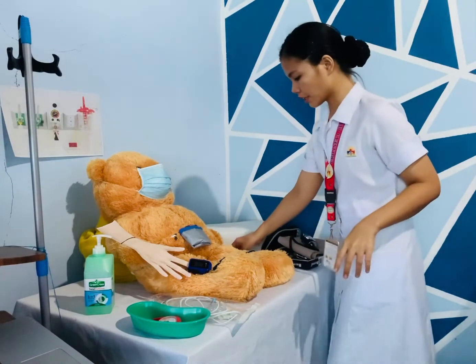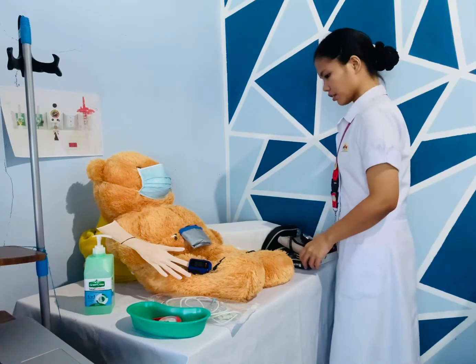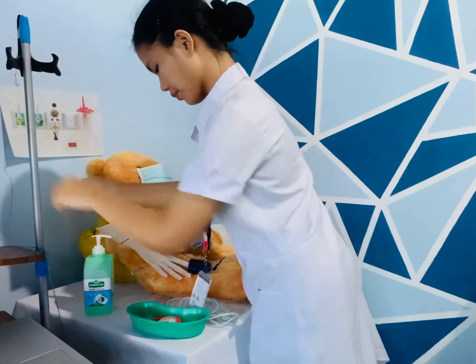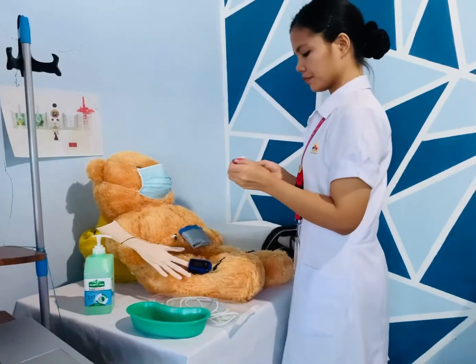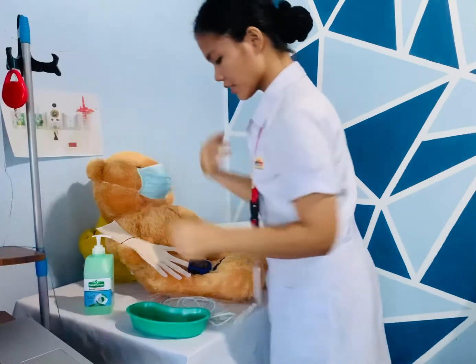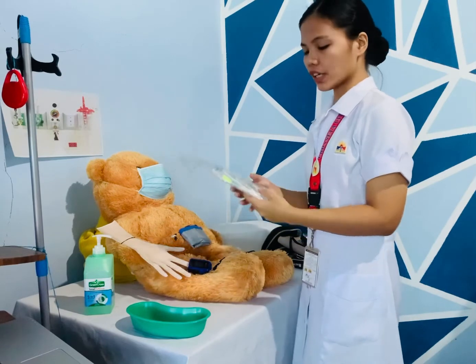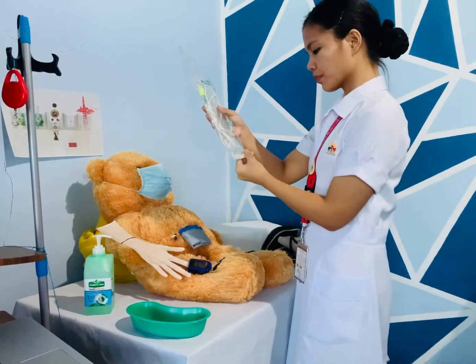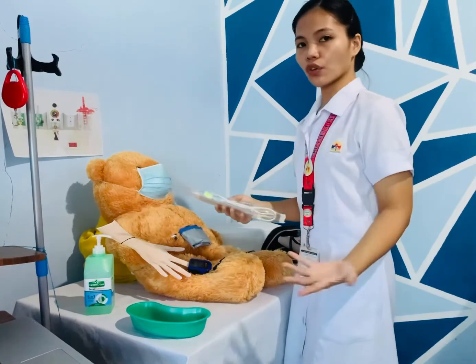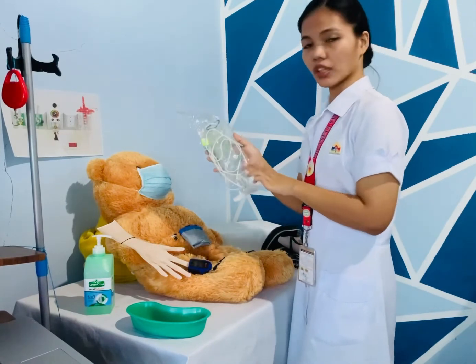Next is to wipe the table with an alcohol wipes. Okay. Then clean the drip stand using the alcohol wipes. Pati na din yung weighing scale. And hang natin. So, sa ating dialysis solution, we need to check the concentration, expiry date, volume, then check for leaks sa pouch. Okay, kung may tubig. And check also for the green pole ring, frangible seal, and the 2 clamps.